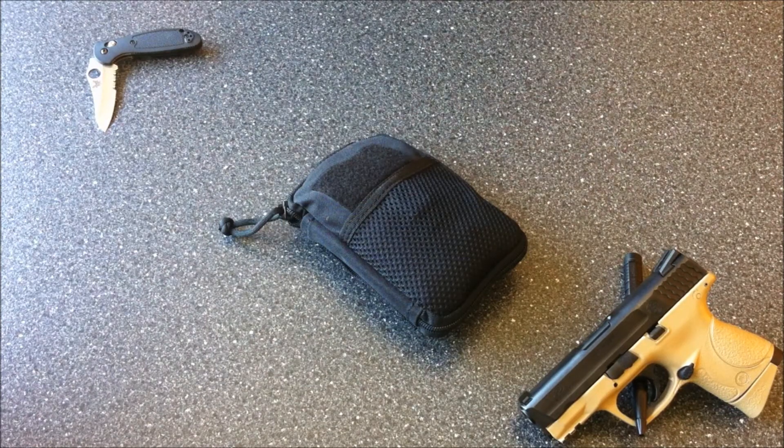I carry this kit on my duty belt. If it's not on my duty belt, it's in my car, and I always take this kit with me when I go shooting at the range or in the country. It's just kind of a mandatory piece of equipment for me.